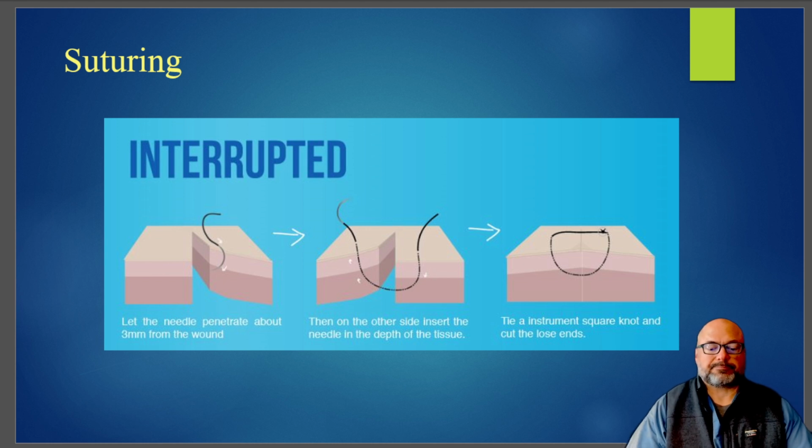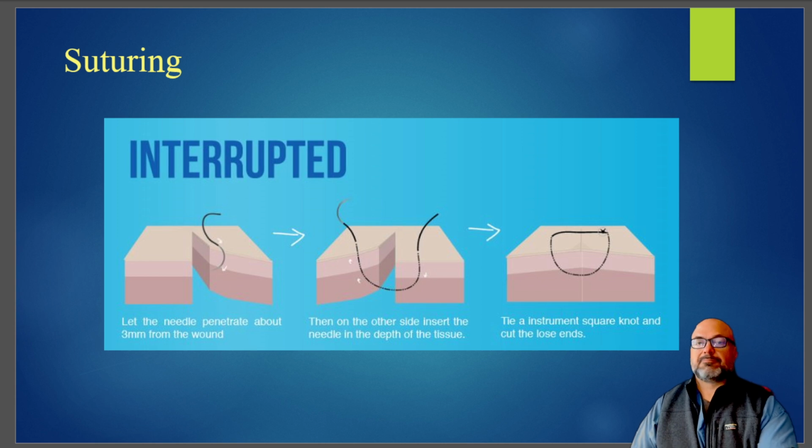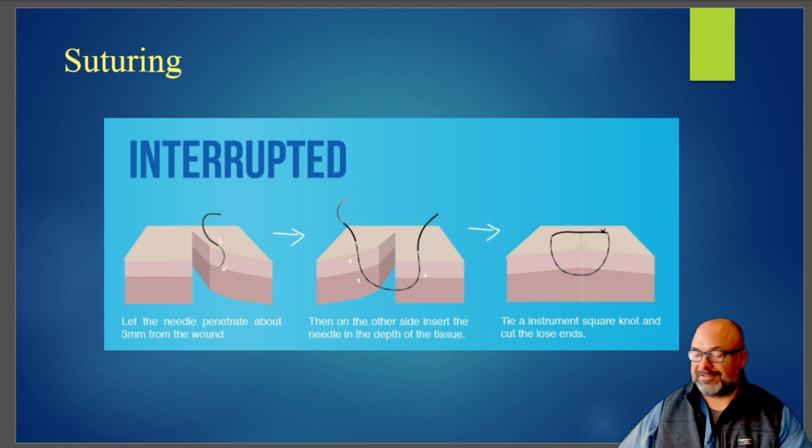All right, so let's talk about suturing itself. I appreciate that most of you have not only seen these suturing techniques, but have probably done them yourselves, certainly practiced them before, I presume. But I just don't want to make any assumptions about what people do or don't know or have done themselves. So we'll start with some basics, and you'll have plenty of opportunity to build upon it in the next several weeks.